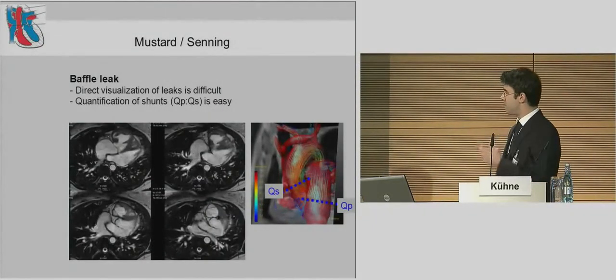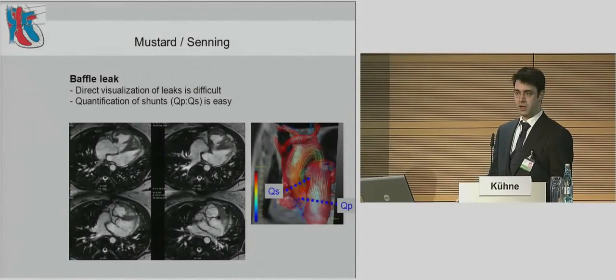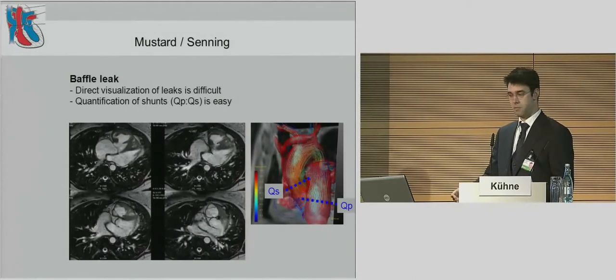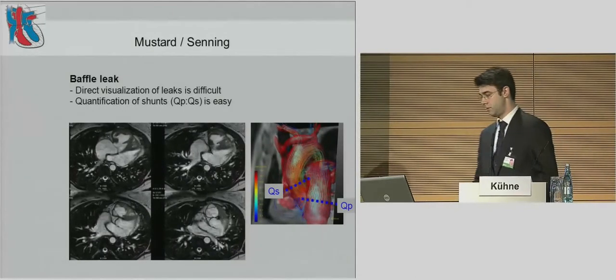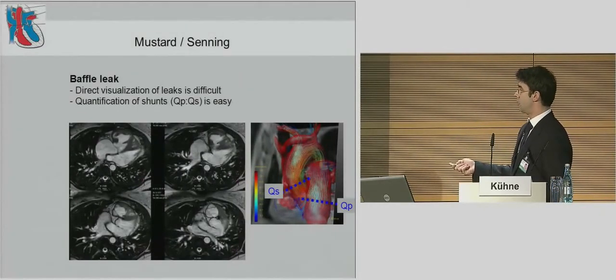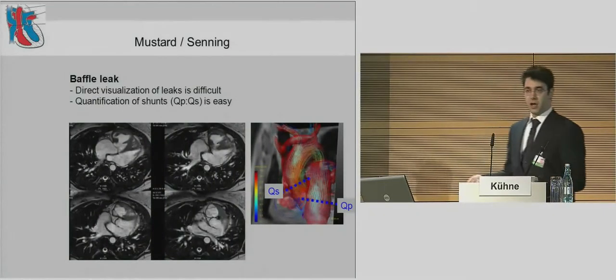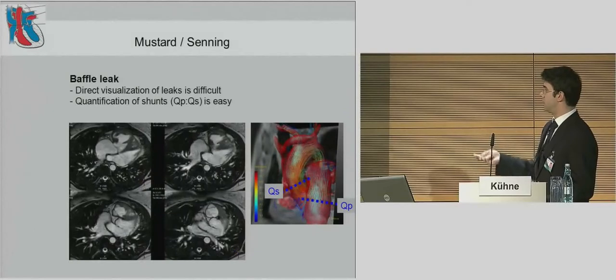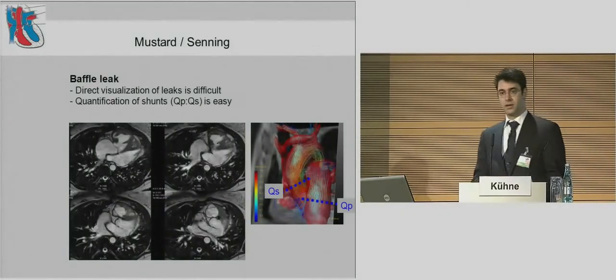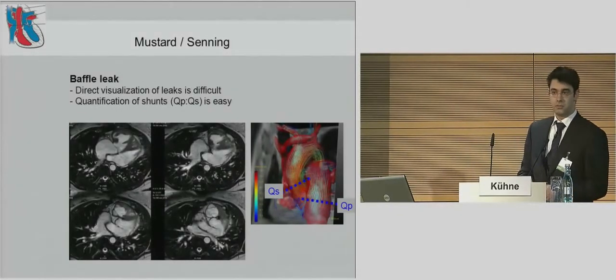So I'm lucky to work with a technique which is pretty standardized, so inter-observer experience is not our problem. So I can lean back and drink a little bit of coffee. The machine is working in the background, and then we're having these images, and then I can go to the cath people and say, okay, look, there's no stenosis in the baffle. Here you can see pretty well the anatomy, visualize one or the other part of the baffle, and so the gross visualization is pretty easy.